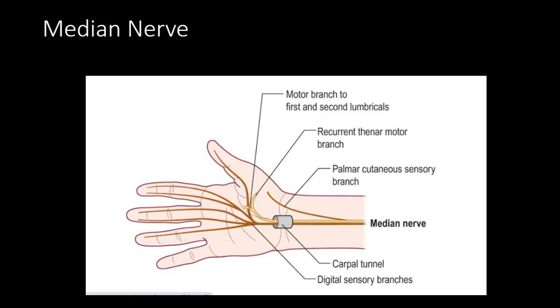As I said, you can do any nerve or muscle. So for the lumbrical muscle, you can do it for axonal neuropathy patients. You want to assess, is it because of the median neuropathy, or is it because of the axonal neuropathy, when you compare the first lumbrical study with the second interosseous study, which is supplied by the ulnar nerve.